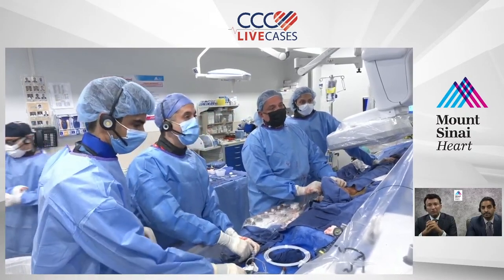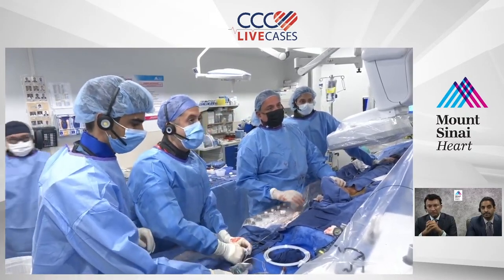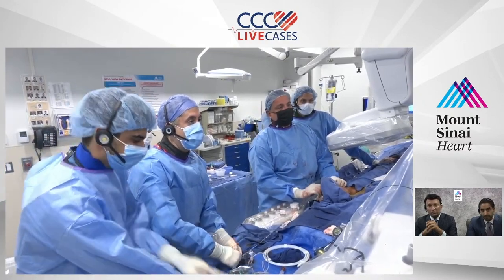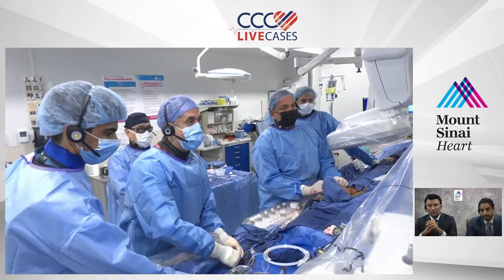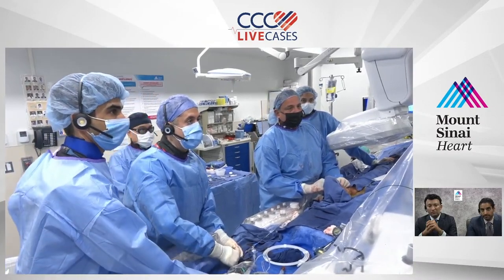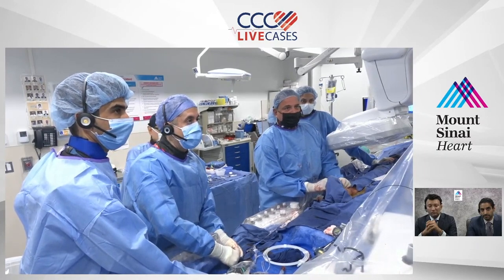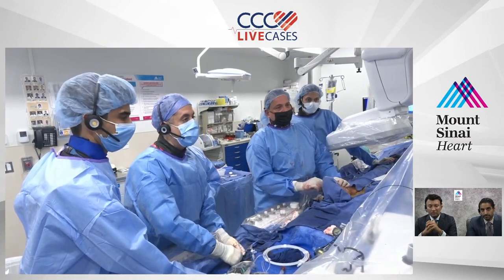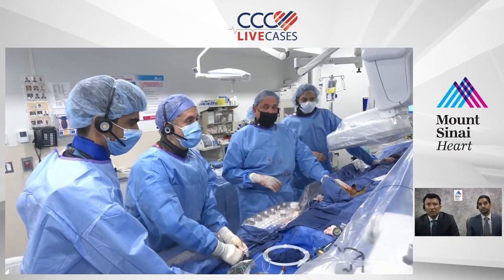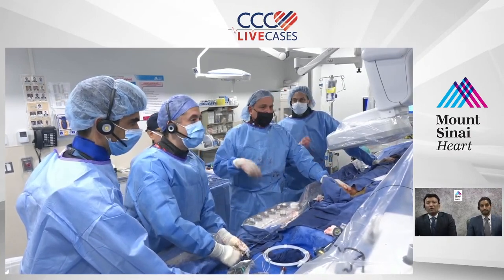hopefully this thing goes. Pull it back so I can get some speed, and then we'll go forward. Wow, look at that. And then if we can do it in one setting, we will. If not, I think we might have to try to come up and over the next time and do it there. It's not going. Okay. So we're going to score and balloon and then just do DCB. I mean, okay, we'll walk this out. We'll hit it on the way out, exactly.